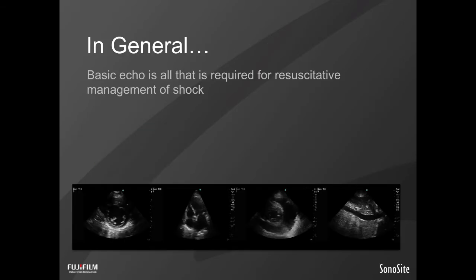I must open with and insist on, however, what I do teach routinely, and I believe most of my colleagues do as well, and that in general, basic echo, as it's known, or basic critical care echo, as I refer to and is referred to in my practice of intensive care medicine, is all that is required for resuscitative management of shock the majority of the time.